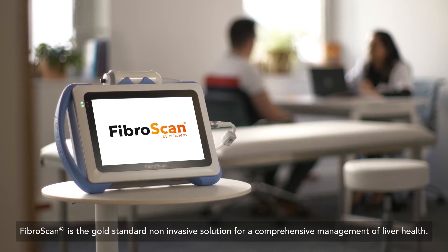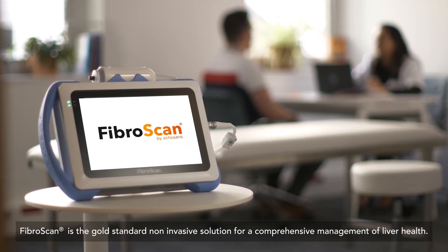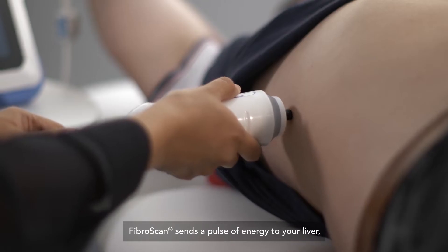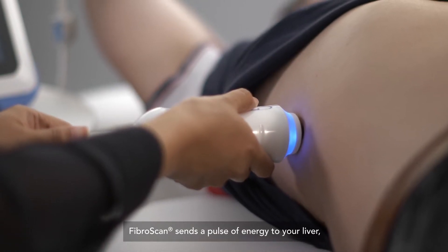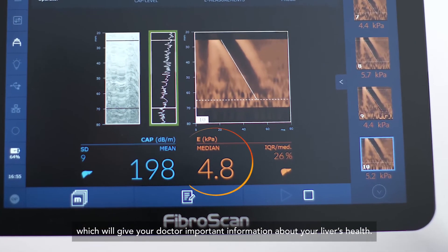FibroScan is the gold standard non-invasive solution for a comprehensive management of liver health. It is called non-invasive as nothing enters your body. FibroScan sends a pulse of energy to your liver, which will give your doctor important information about your liver's health.